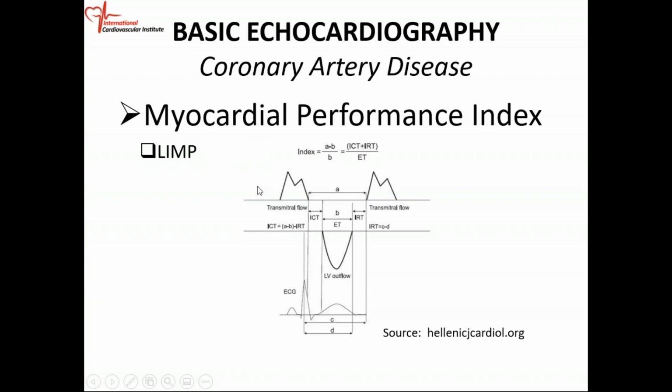All right, so if you look at your mitral inflow Doppler, the mitral valve opens, you have your E velocity, rapid filling, and then your diastasis, then your atrial contraction, then the mitral valve closes. Okay, so all of this period of time, the mitral valve is closed. Then the mitral valve opens again. Remember, the definition is mitral valve closure to mitral valve opening. So that is this duration. It's a time thing. The whole thing is time. So from mitral valve closure to mitral valve opening, that's this duration.